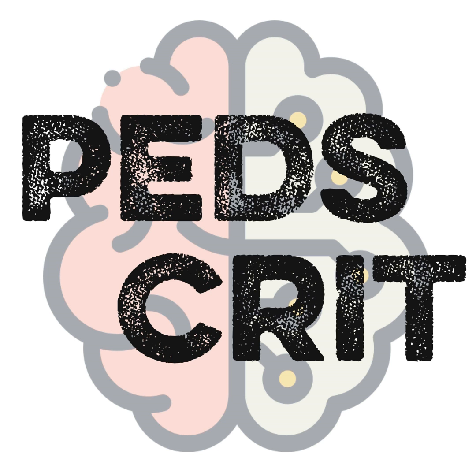Yeah, one of the perceived benefits of APRV is that it's thought that the spontaneous breathing component really helps to redistribute lung volume to those dependent portions of the lung where the perfusion is higher, and so should help with the VQ mismatching that occurs in lung injury. So ideally, yes, you would see that number narrow. Now, if it was widening, I don't know if I would take that as the sole consideration into whether I'm doing the right thing or not, but certainly one of many data points to consider.